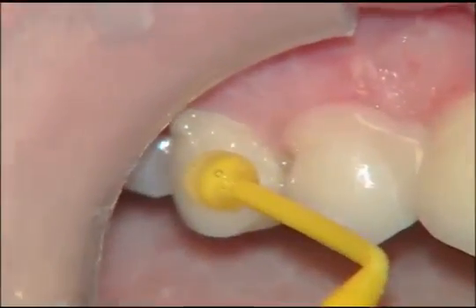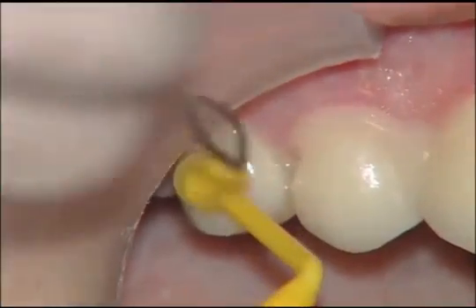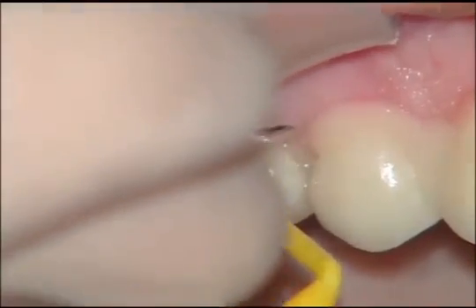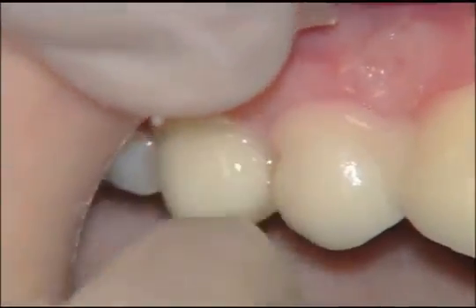We're now placing the bicuspids into place, and again with these smaller veneers, it certainly is nice to be able to use the Viva sticks, and then I'm just going to hold on to the restoration with an Explorer while I pull the Viva stick off the restoration.